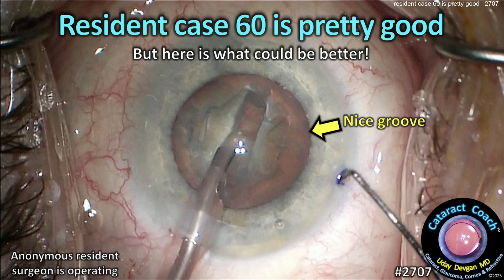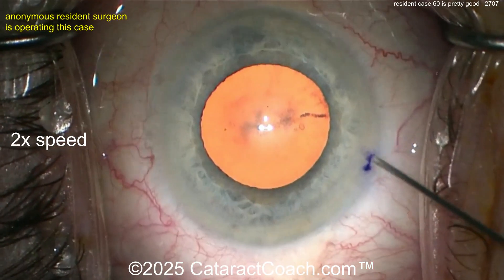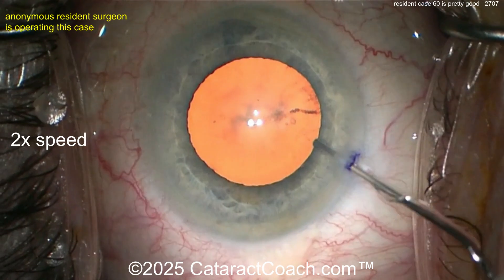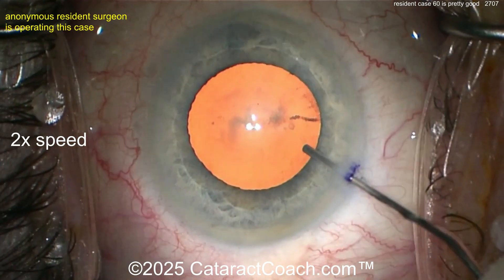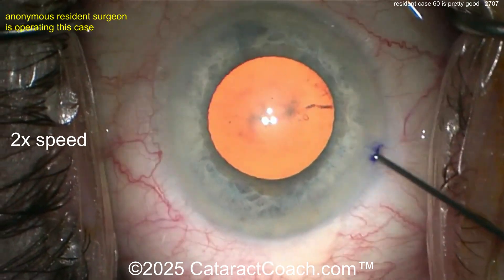CataractCoach.com resident case 60 is pretty good, but here's what could be better. We have an anonymous resident operating here — case number 60. If you're around that benchmark, compare yourself and see what we can do. We sped the video up to two times normal speed, and we already have the pairs and pieces inside the eye. In case 60, even in case 600, it's not about speed — do not worry about speed.